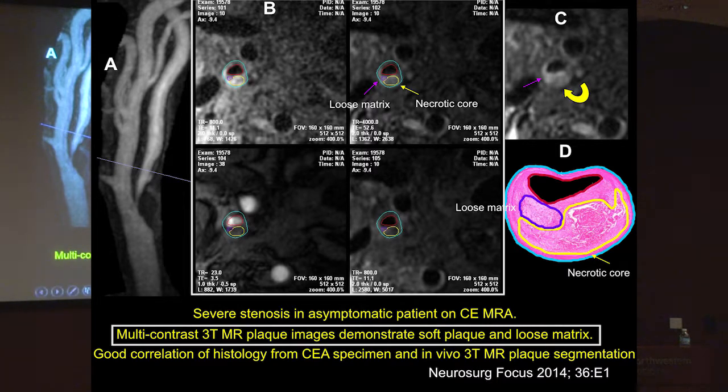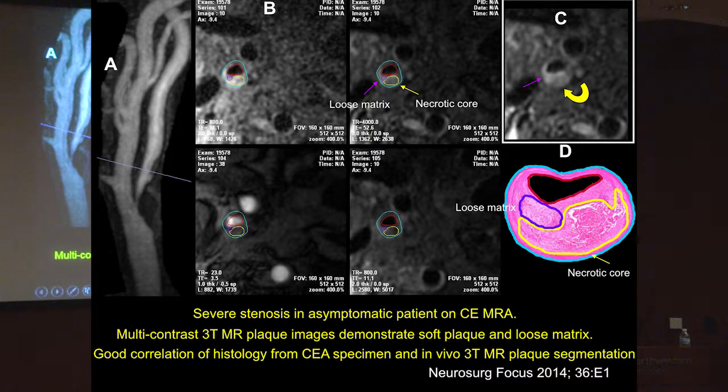Where the magic is, is in some of the multiple software packages that are available that allow you, in research mode, to do a pixel by pixel analysis and predict what the various plaque components are. What I've done here is taken the markings off of the T2, and this large area that's dark on T2 was the non-hemorrhagic necrotic core.